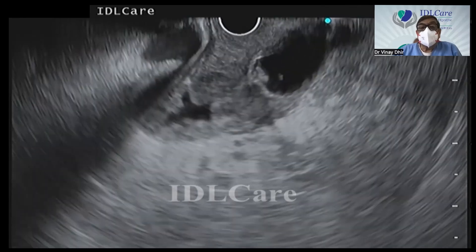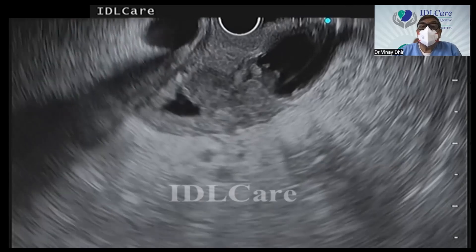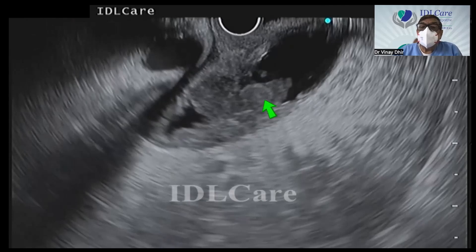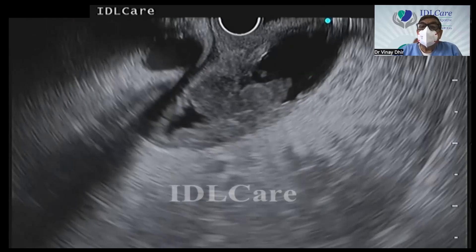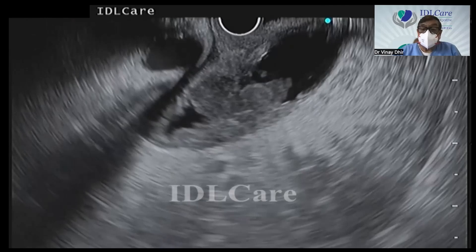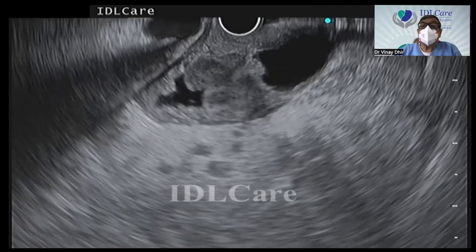Always put water if you want to see things clearly. You can see I'm filling it with water here, and beautifully seen: a hypoechoic lesion in the ampullary area. Now you see here — this lesion seems to be involving the bile duct. See this — it is jutting into the bile duct. This of course is sludge. So: duodenum wall, ampulla, lesion at the ampulla, and you see this sludge.